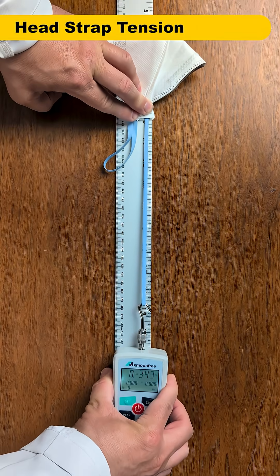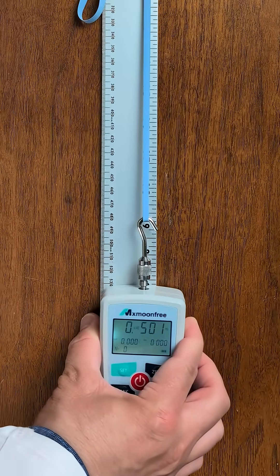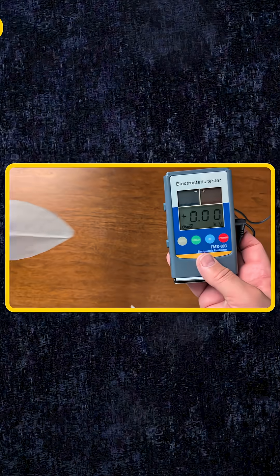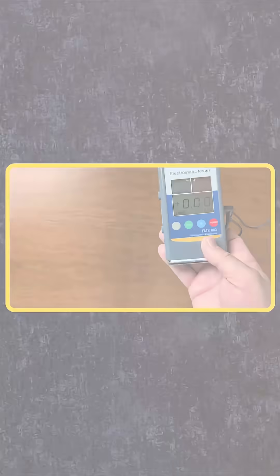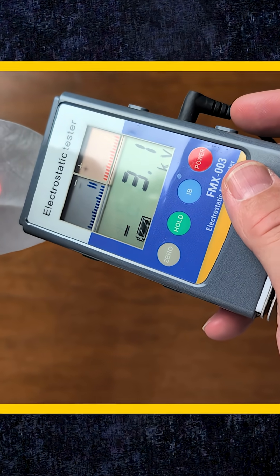Let's take a look at the head strap tension. There is some variability between all of the samples, but there is an overall match between my reference Auras and this batch. I also tested the electrostatic charge of the inner layers of the mask with an electrostatic charge meter, and it's an exact match between both sets.